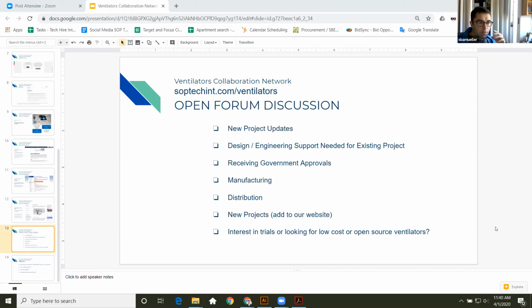Yes, somebody else has a comment there. Is that Sebastian? As we are looking at different systems, we have different motors. One of the systems currently apparently mass produced in Spain uses a windshield wiper motor. And apparently they seem to regulate the amount of pressure and time with a fairly simple mechanical sort of wheel-shaped device. So I'm sort of lacking the English terminology for that.